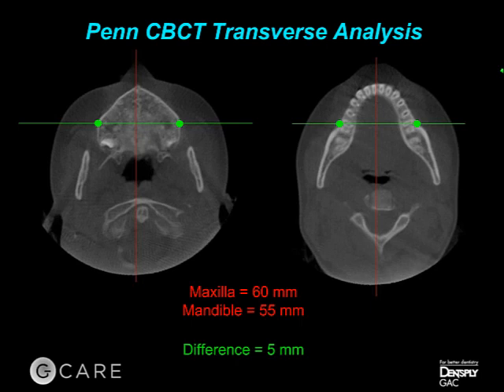And as we started going through this with 10-15 cases that we saw, these untreated samples that looked like this, they all measured right around 5 millimeters of difference, plus or minus 1/4 to 1/2 millimeter. So as an objective measurement, as something that is quantifiable, our goal then is to get our upper jaw 5 millimeters wider than the lower in order to have those teeth, again, upright, centered, and well intercuspated.